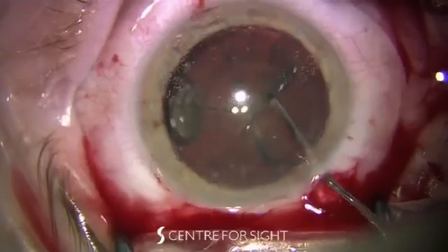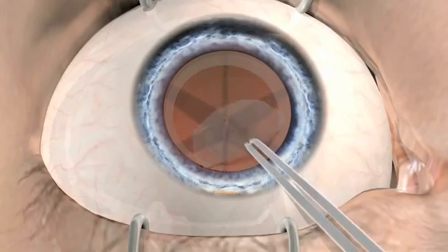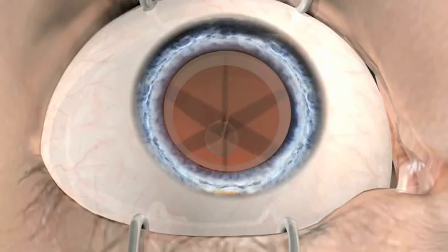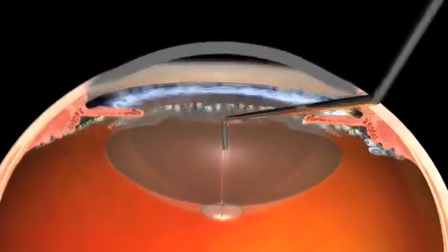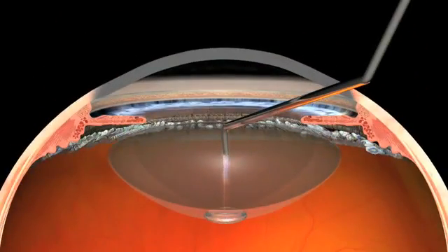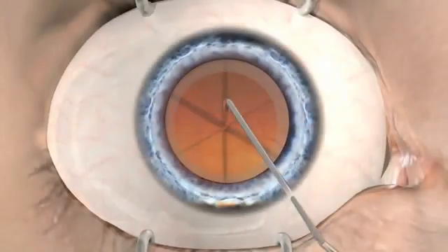This animation helps to understand the process of translenticular hydrodissection. Fluid enters the lens through the cleavage plane. It goes posteriorly and hydrodissects or hydrodelineates the lens, depending on the depth of the lens fragmentation. Excess fluid does not become trapped and comes out around the cannula, avoiding capsule block. Without posterior pressure, the lens is easily rotated.